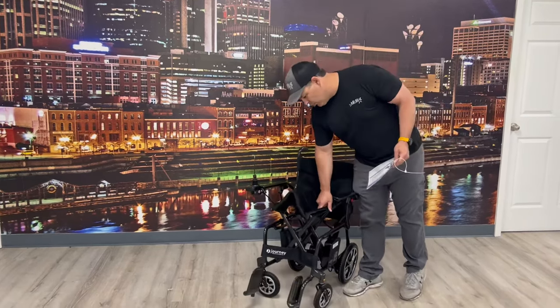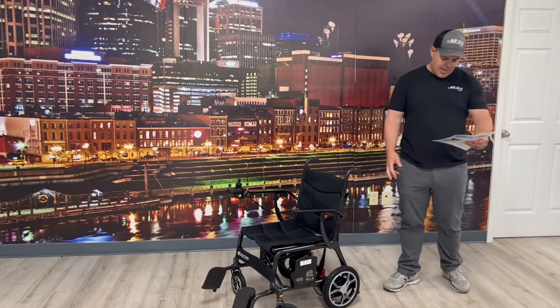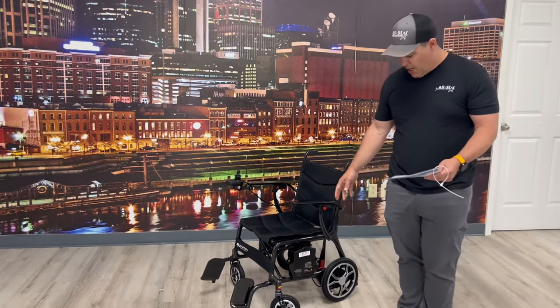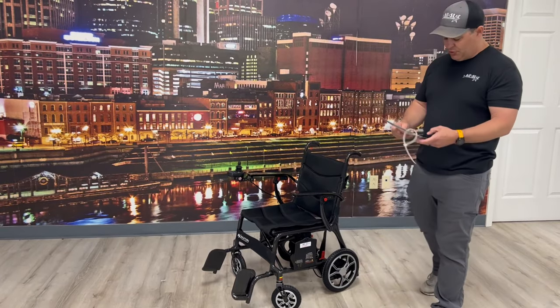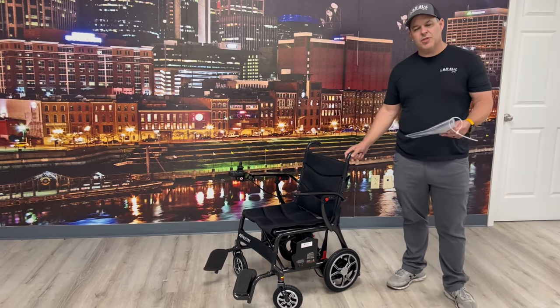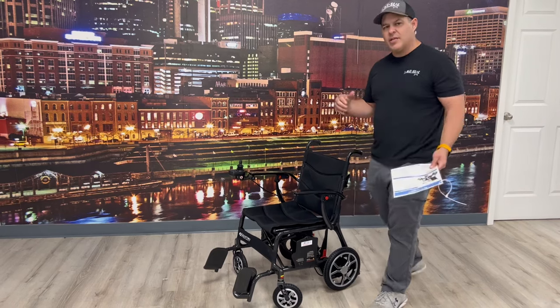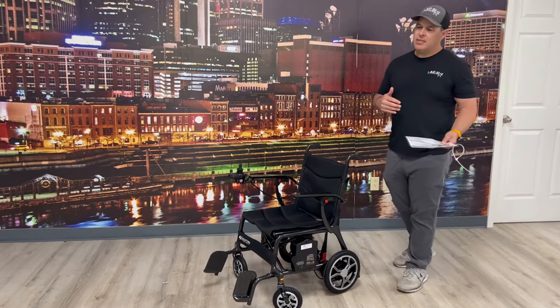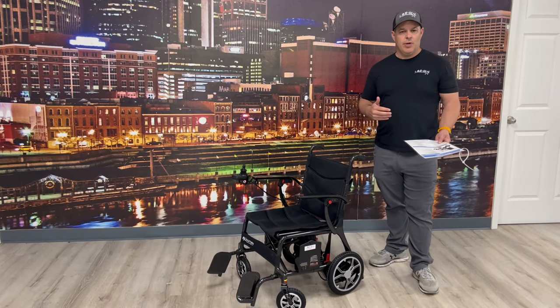This unit is 26 pounds when you take the battery off, so it's really lightweight — there's not a lot like it on the market. Going over a couple of specs: your rear tires are 10.6 inches, so a large rear wheel, and your front tires are six and a half inches. It has a six-to-eight-hour battery charge time and a travel range of right at 10 miles. That range can depend on the weight of the individual and the terrain.